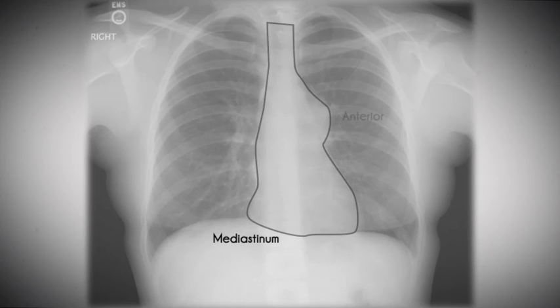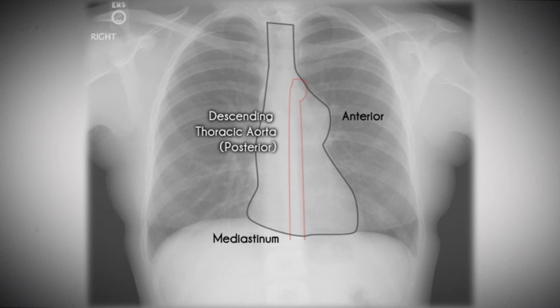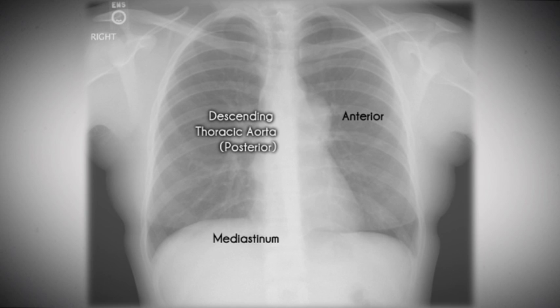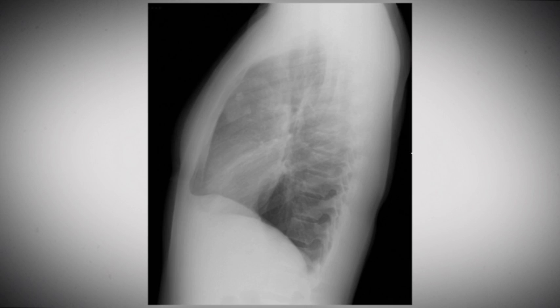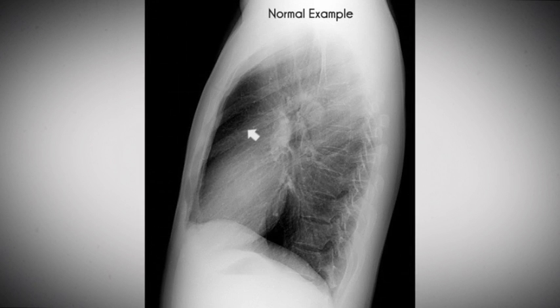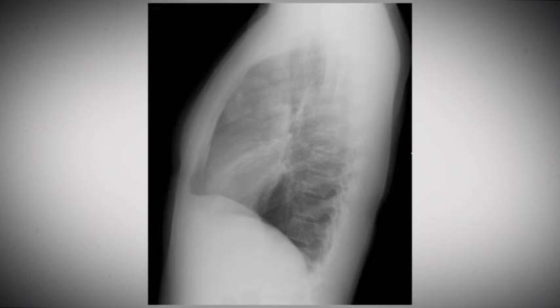The lesion is probably anterior because it is obliterating the main pulmonary artery, which is an anterior structure. At the same time, the normal descending thoracic aorta can be observed, which is posterior to the lesion. The mass produces a convexity and obliterates the normal contour of the pulmonary artery, and thus needs to be explained. From the lateral view, in place of the normal retrosternal clear space, there is a soft tissue mass with a couple of densities within. Normally, a lucency in the retrosternal space should be seen above the heart; instead, here is a soft tissue mass with some calcifications.